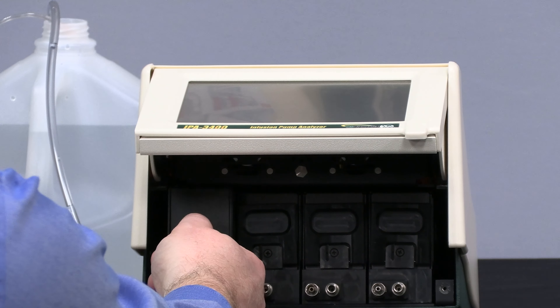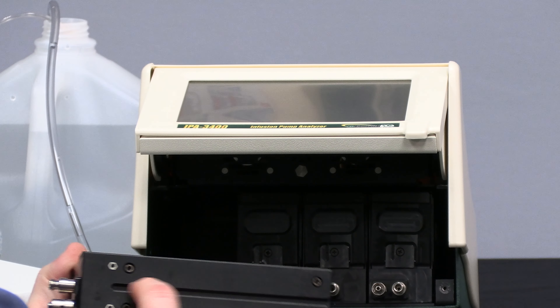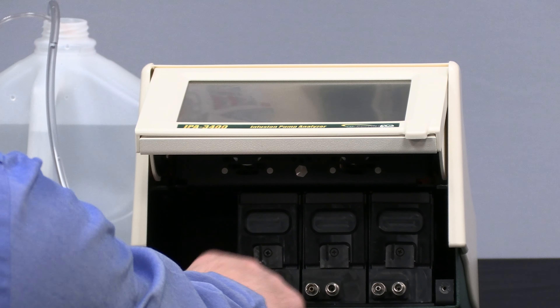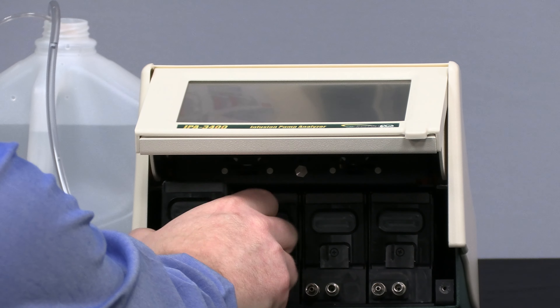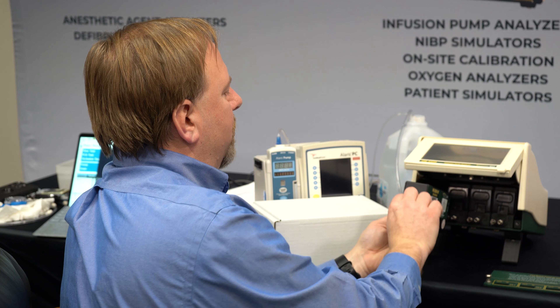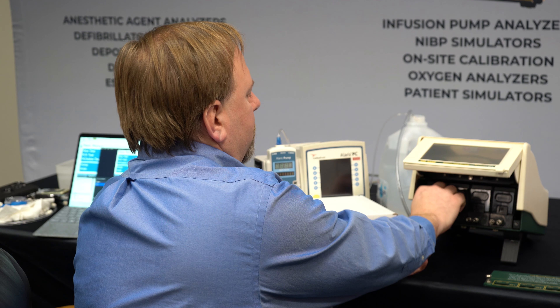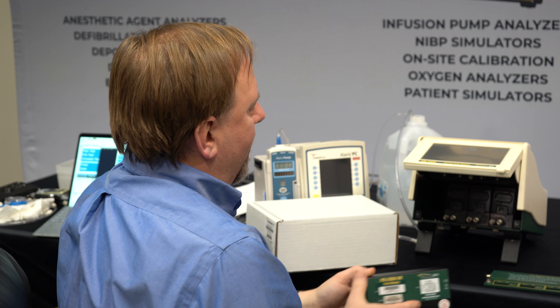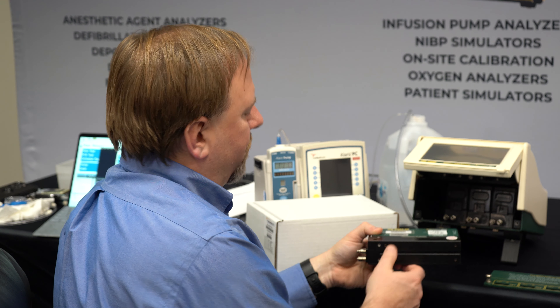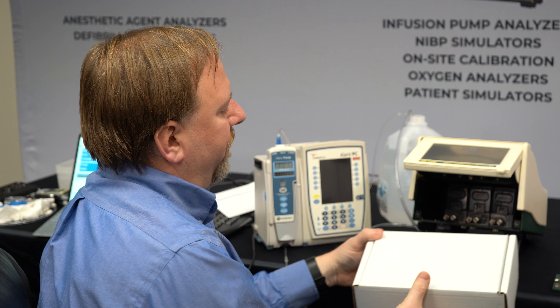We can set the panel down. Now we have to remove the thumb screw for the channel that needs to be calibrated. There's a flip-down handle on the module that allows me to gently pull out the module. I need to pull it straight out — there's a key in the bottom of the 3400 that keeps it from tilting. When we put it back in, we just push it straight back and it should click into place. As long as we can screw in the thumb screw at the bottom, we know it's fully seated.